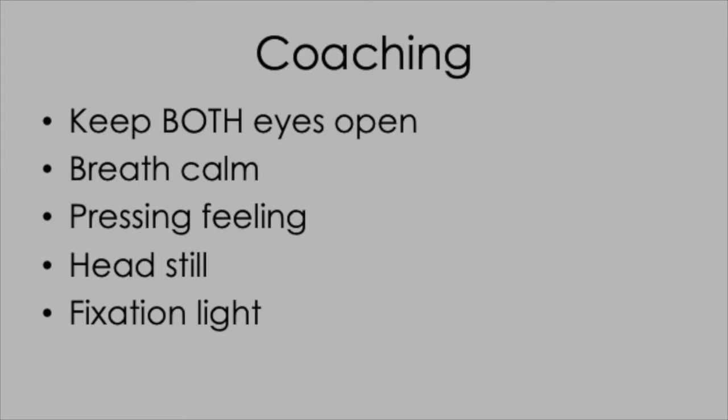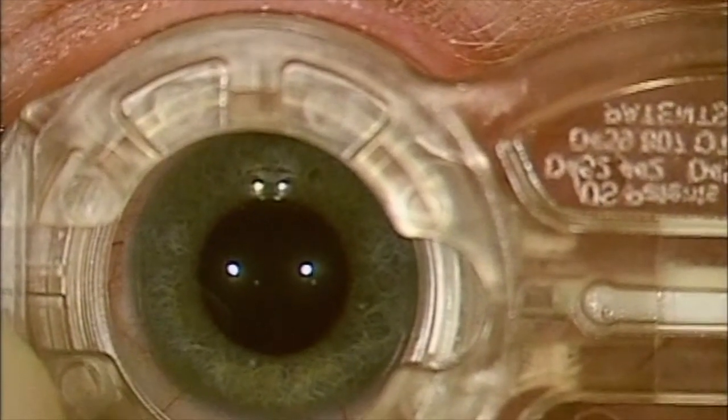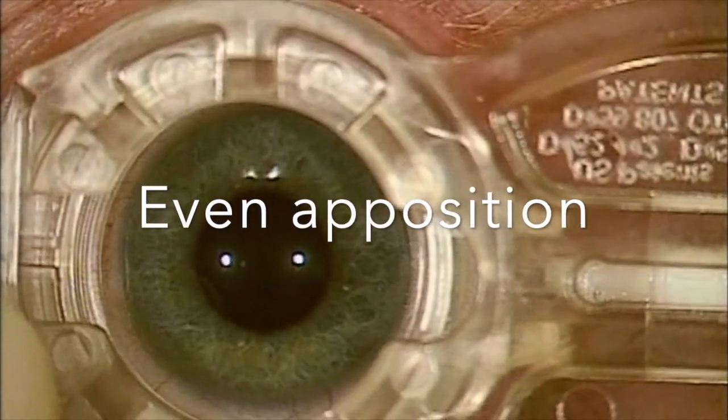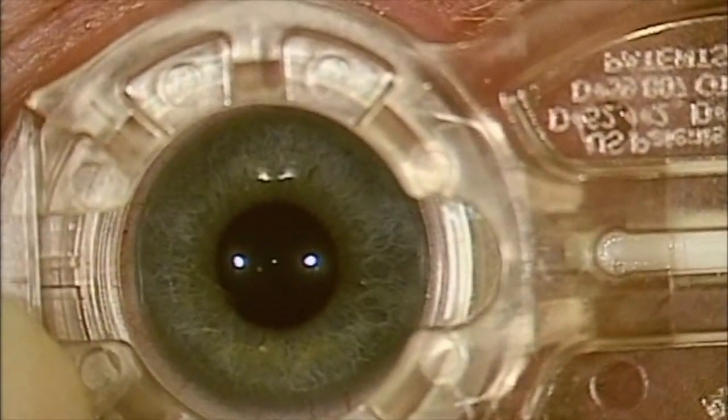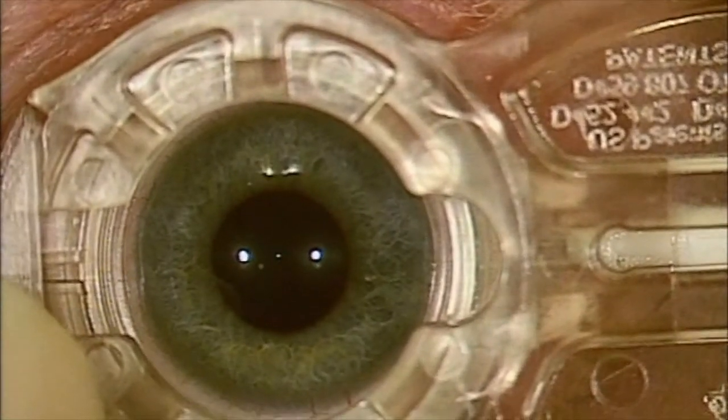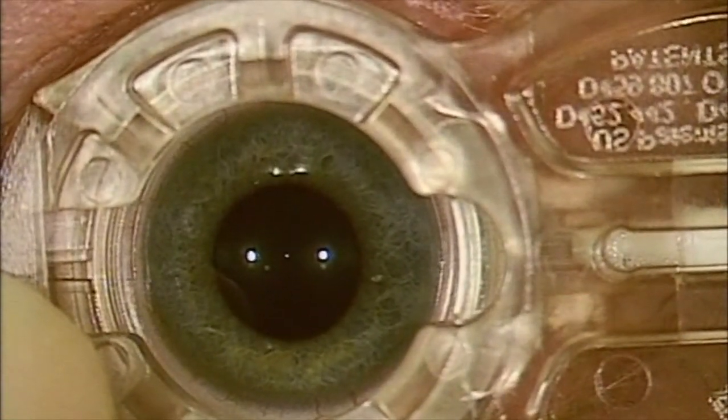Once you're happy with centration, it's very important to establish even apposition, because if you don't do that before you apply the vacuum, the eye can roll and you can lose the centration at that point.